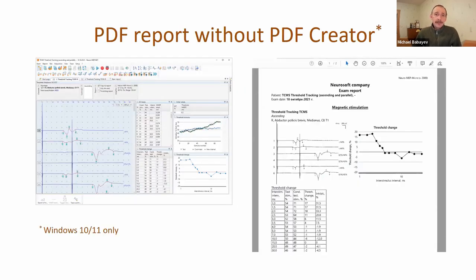Now it's possible to create a PDF report without a separate PDF creator. From some hospitals and clinics there is a demand that when the doctor finishes an examination, creates a report, and closes the examination, the report should be automatically copied to a folder - usually a hospital information system. Previously it was necessary to install a PDF Creator program, but now we use the PDF printer that is embedded in the Windows operating system.